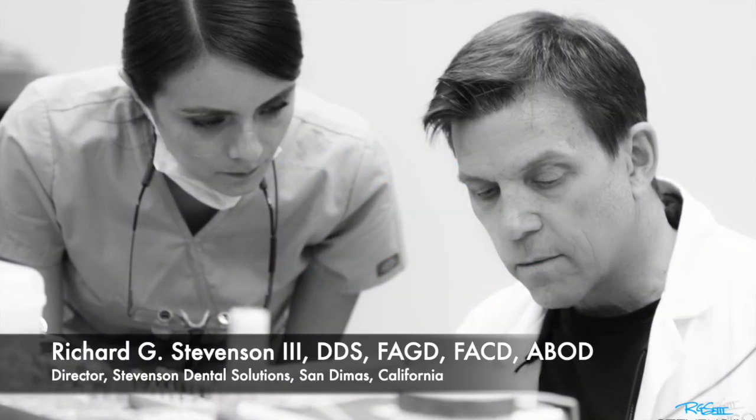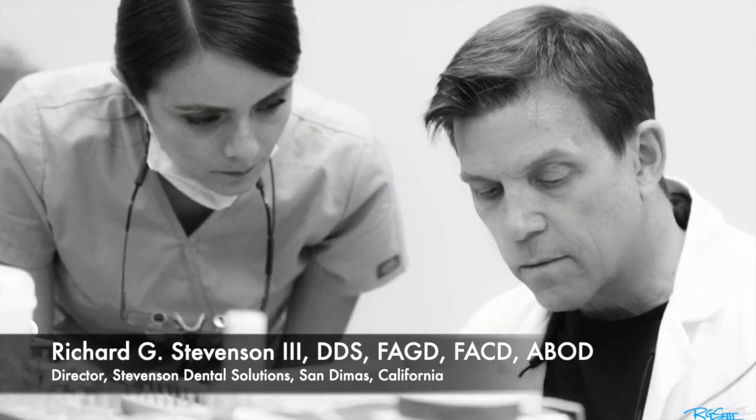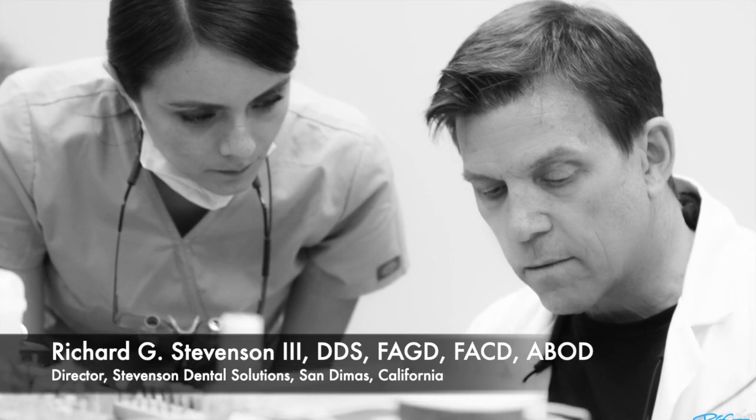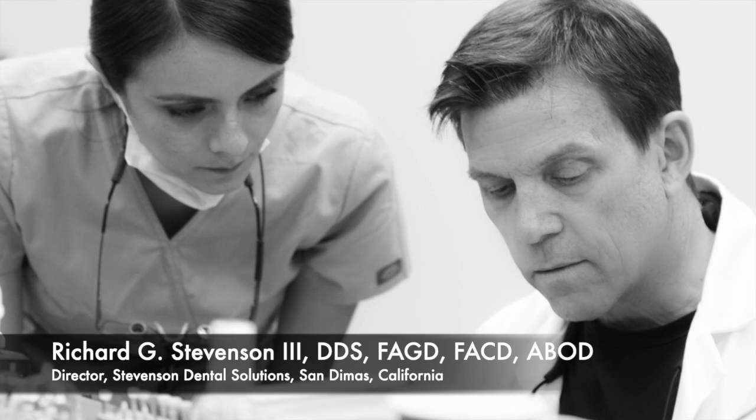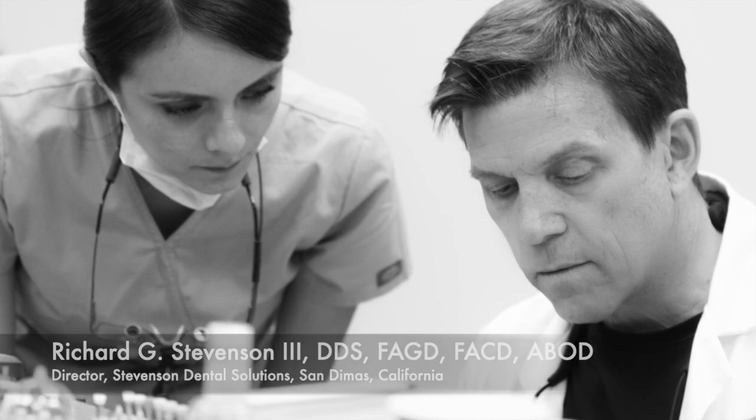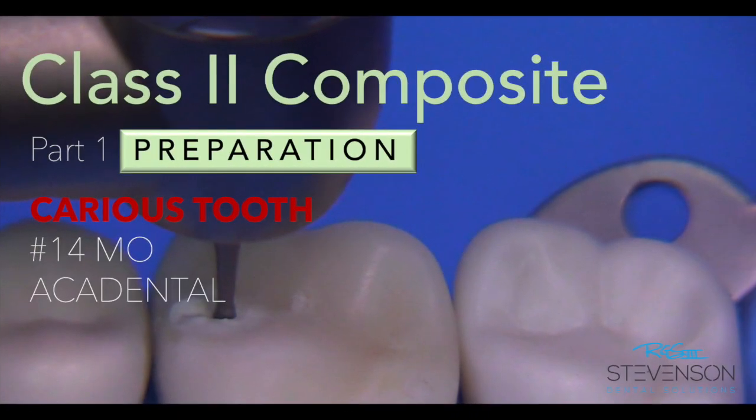Hey everybody, I'm Dr. Richard Stevenson and I'm the director of Stevenson Dental Solutions in San Dimas, California. Today we're going to tackle a new project — it's an old preparation, it's a class 2 composite, but we're going to utilize one of these carious teeth from Accadental.